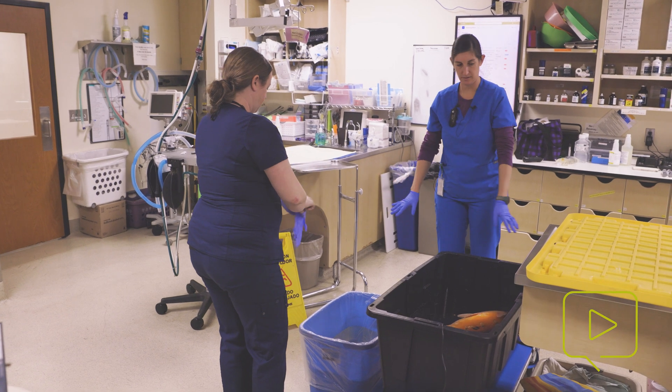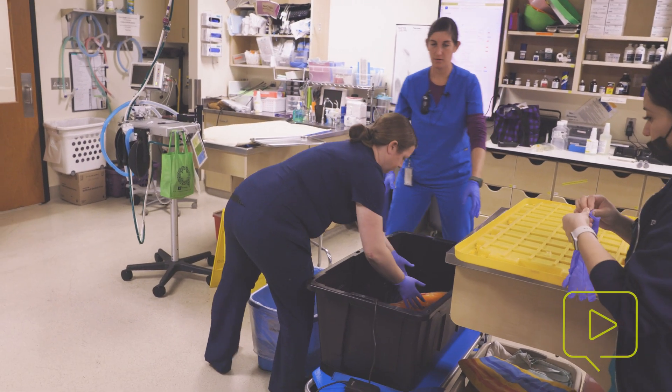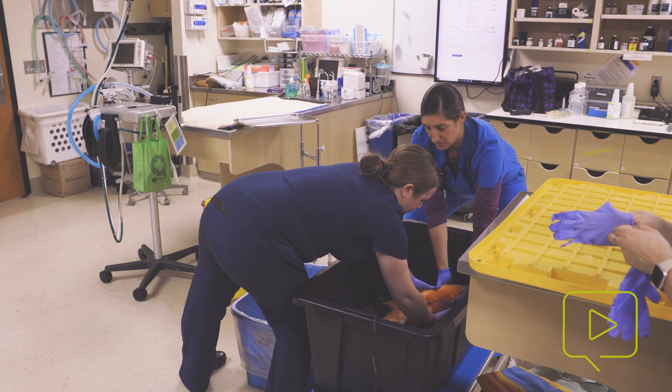If we have something to put over the top of this — so she can't jump out. Now we're going to lift Joanna into the anesthesia solution.